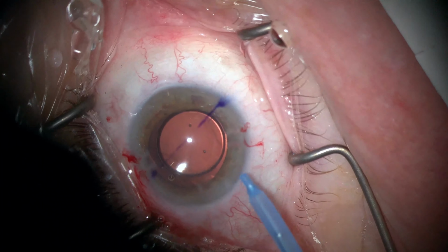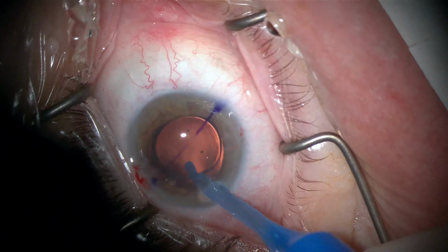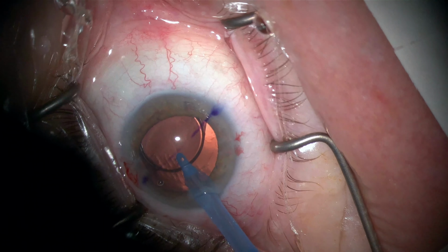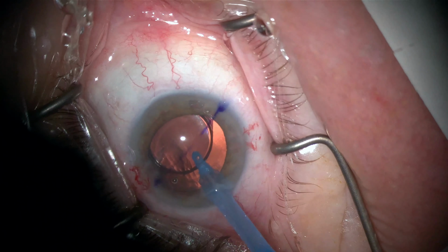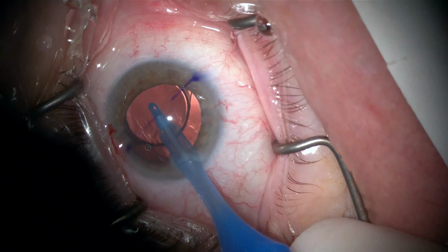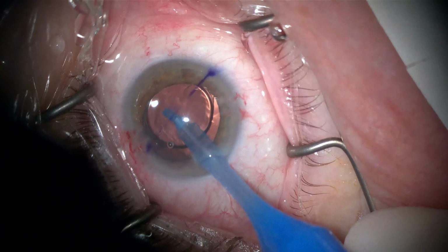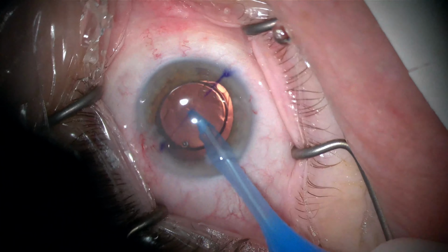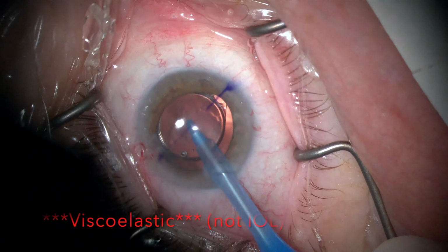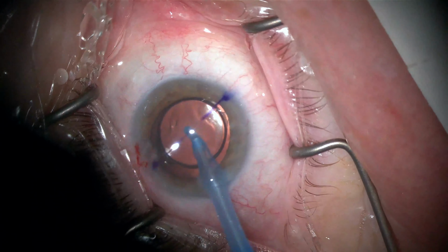And in all toric IOL cases, it's imperative to really get underneath the IOL and remove all of the viscoelastic from the capsular bag. And in this case, since we put a lot of viscoelastic in, it's very important to do a good IA at the end of the case. So once the viscoelastic is removed posterior to the IOL, the same maneuver is performed to really remove the viscoelastic from the anterior chamber and the sulcus space.